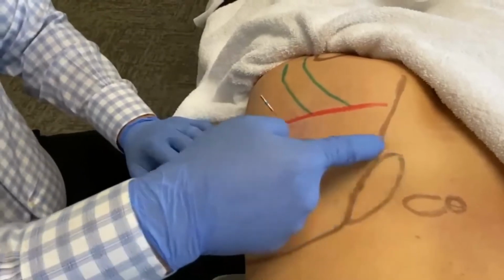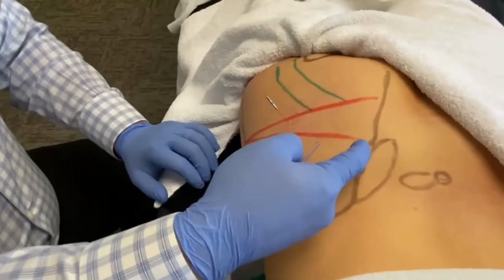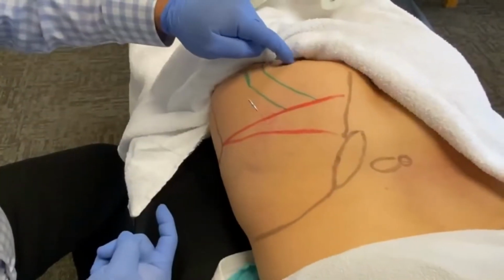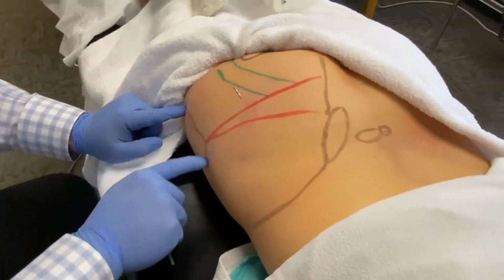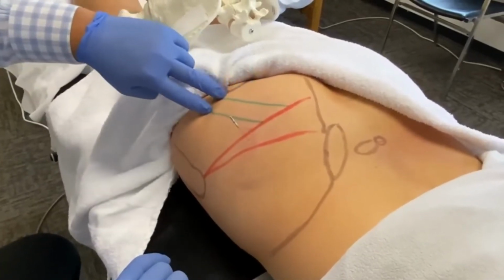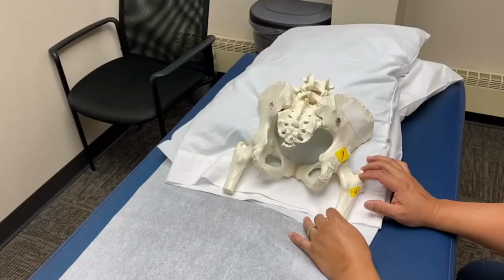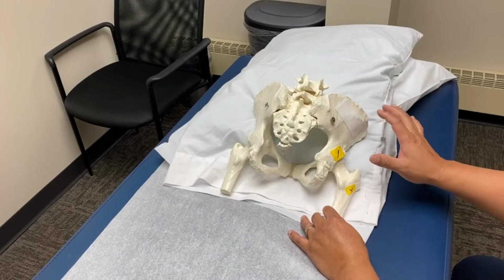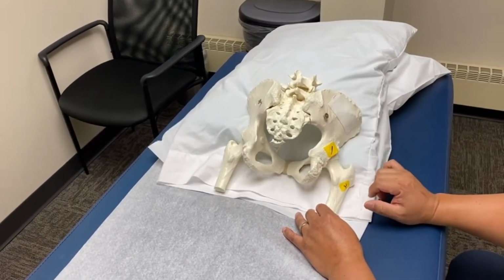What we have here is the PSIS, iliac crest, L5, the lateral border of the sacrum, the ischial tuberosity, and the femur and greater trochanter. This green arc here is the pathway of the sciatic nerve. To protect my patient's modesty, I'm going to continue this technique demonstration using this pelvic model.